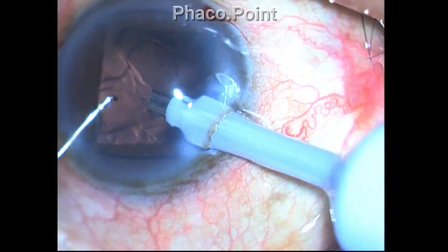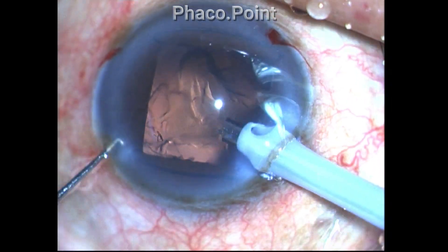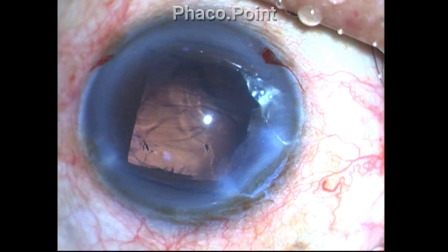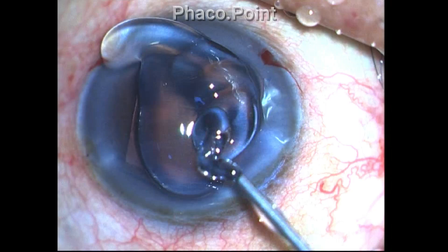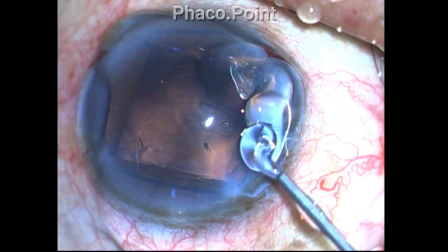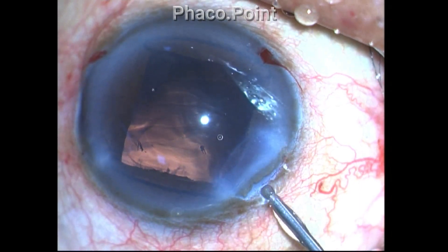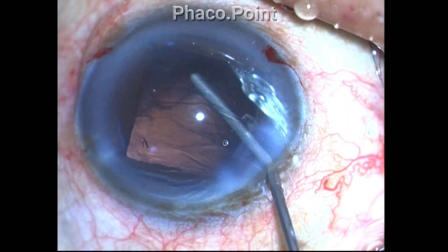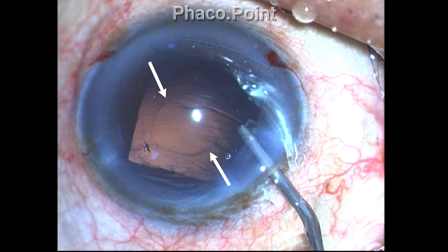However, when I went after this final piece, it is at this point that the phaco tip inadvertently touched the posterior capsule, which in such cases tends to be extremely thin. I did not notice it while pulling the phaco probe out. But while insufflating the anterior chamber with viscoelastic, I noticed that something was amiss — and this is when I found that there was a discontinuity of the posterior capsule.